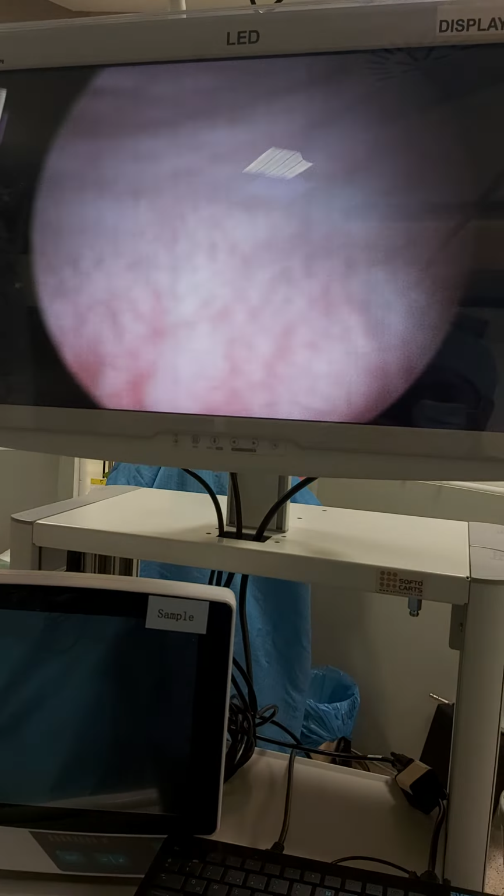And why don't other urologists see anything in these bladders? Look, when I come from the urethra, if I don't adjust my focus very well when I go inside, and take a quick look at the ureteric orifices like this, I may not understand the problem here. It's always obvious to me there are problems for sure. But when you adjust your focus a little bit better, like this, it's very prominent.